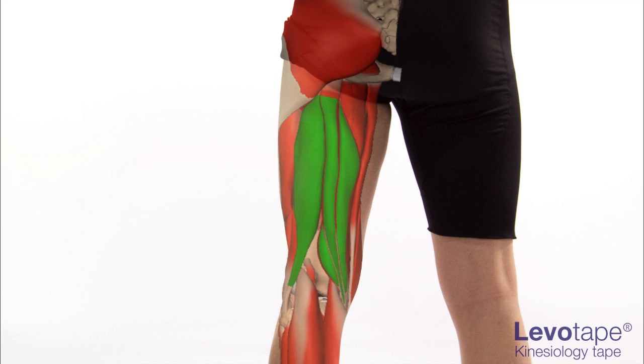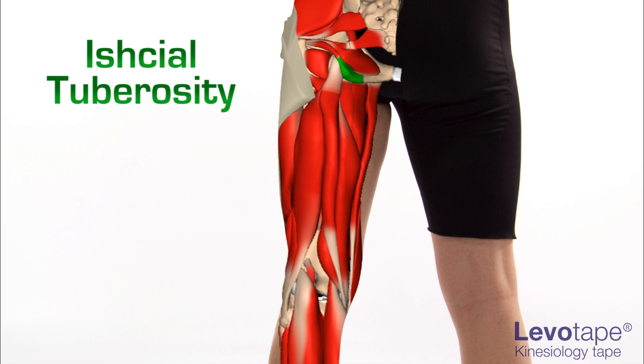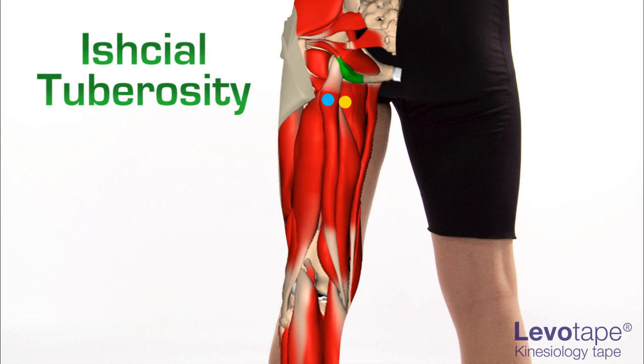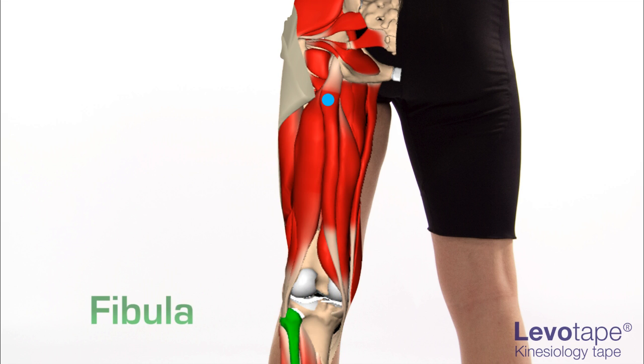This technique requires both an I strip and a Y strip. The base point of the I strip is located by first measuring 2 finger breadths below the ischial tuberosity, and from that point measuring 2 centimeters laterally. The end point extends distally to the head of the fibula.